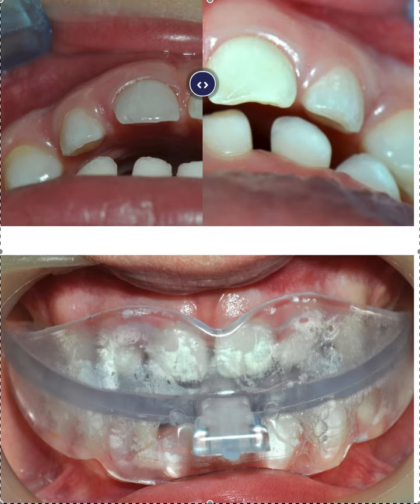I wouldn't be billing only D8060 for this — this is part of a D8060, but later you're going to need to go in and finish the job, which is generally interceptive treatment. It's Phase One: we're fixing the bite completely, and we're also fixing the anterior segment — the front four incisors — as needed.